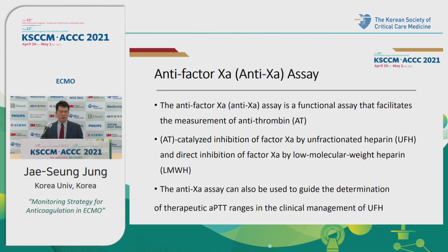The last one is the anti-factor 10A assay. The anti-factor 10A assay is a functional assay that facilitates the measurement of antithrombin-catalyzed inhibition of factor 10A by unfractionated heparin and direct inhibition of factor 10A by low molecular weight heparin.